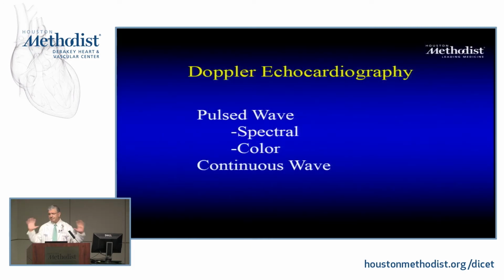So we talked about imaging, okay? That's the first half. The second half is talking about Doppler, its applications, and a few other things. So let's talk about Doppler now. It's very interesting because I sent this ultrasound, and it went there, and my first question for this half hour was, how fast did it reflect?